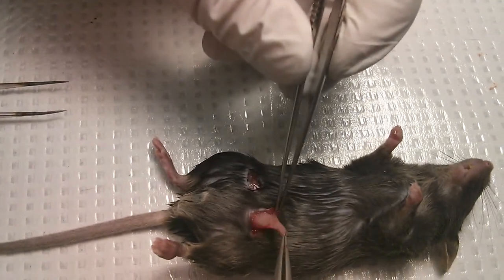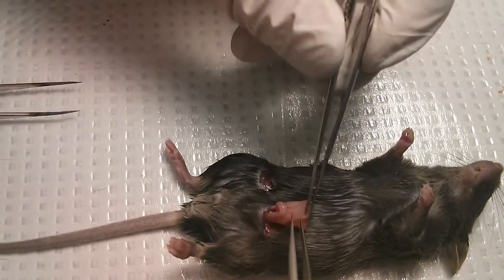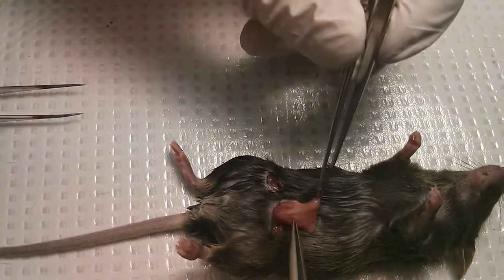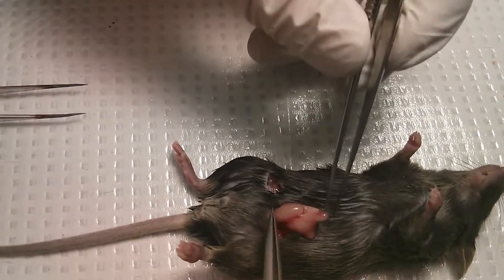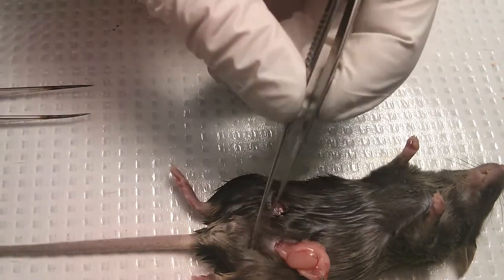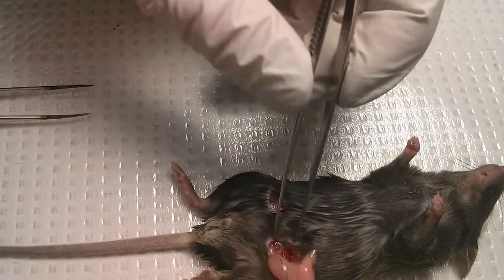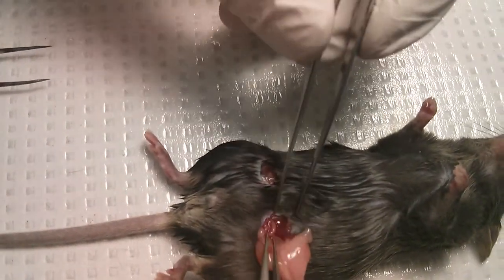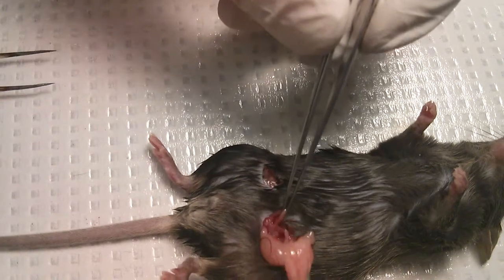...you grab the fat and you pull — so this is the epididymis coming out and the testicle — you keep pulling, and you see the vas deferens, this small tube here.